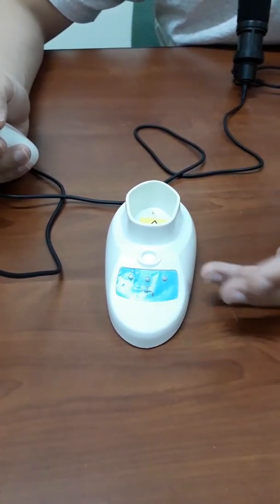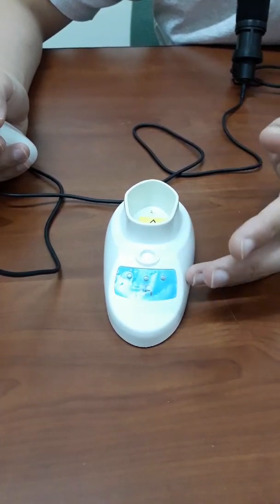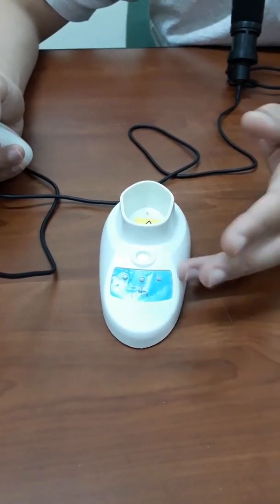So in this case, you need to contact your dealer for repair or for checking.